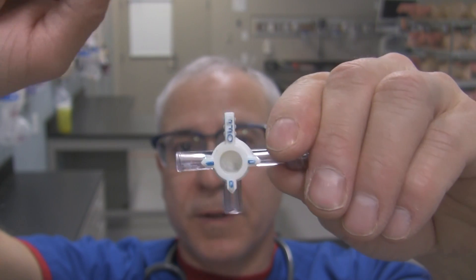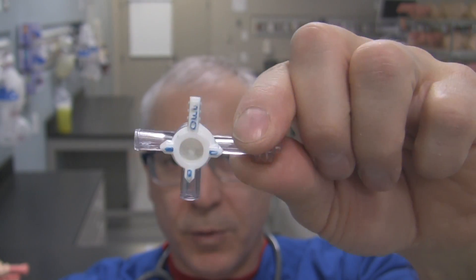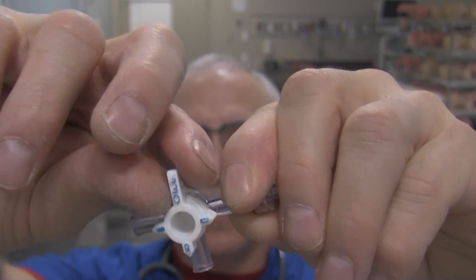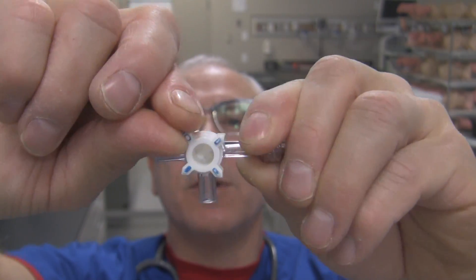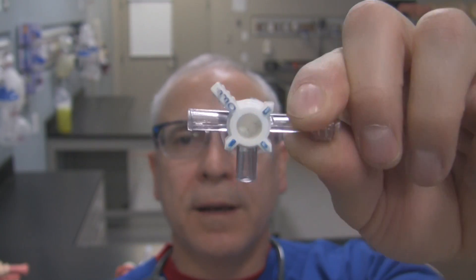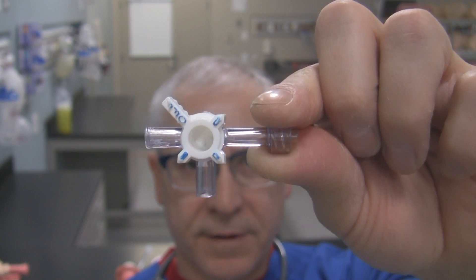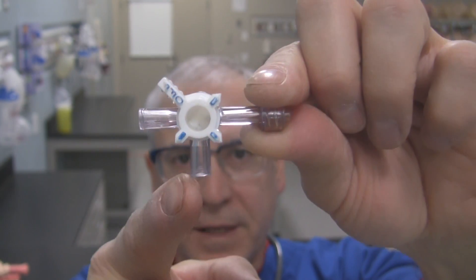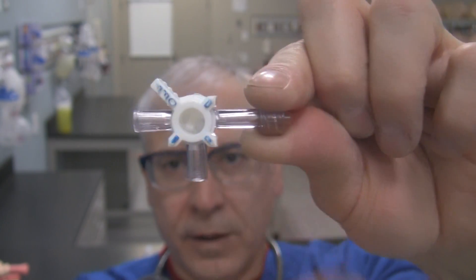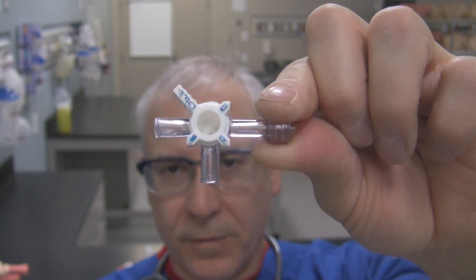So that's how a three-way stopcock works. Now if we wanted to isolate all the ports from each other, what would we do? All you have to do is simply take this off tab and move it 45 degrees like so. Now nothing's lining up with any ports, so that means the stopcock is in fact now closed. This female, this female and that male port right there — they don't communicate with each other. So nothing's open right now.